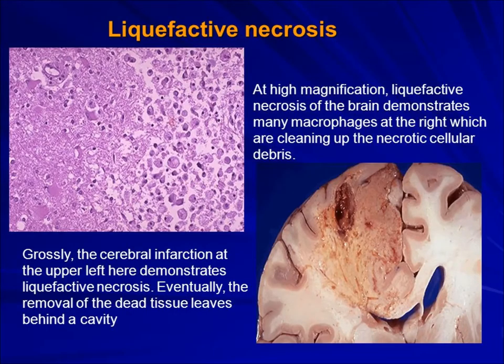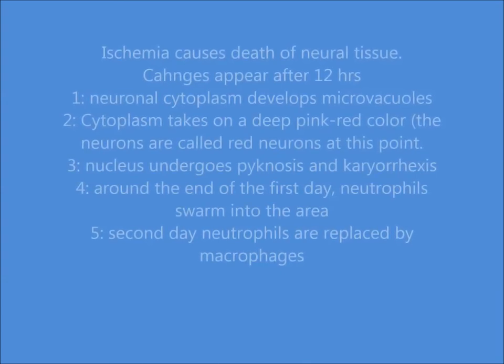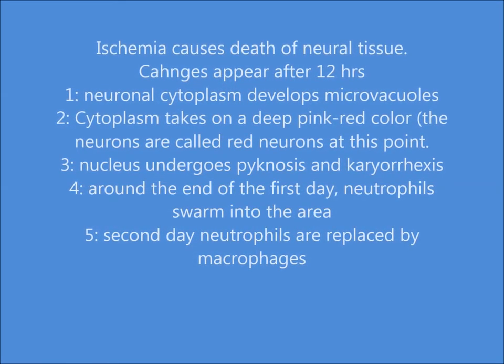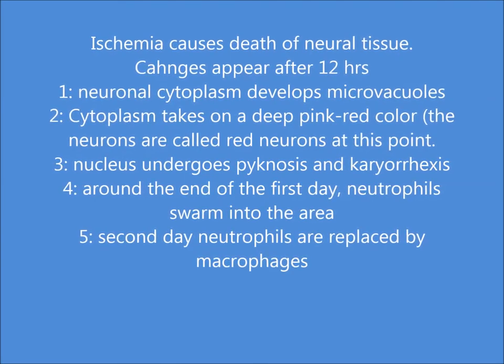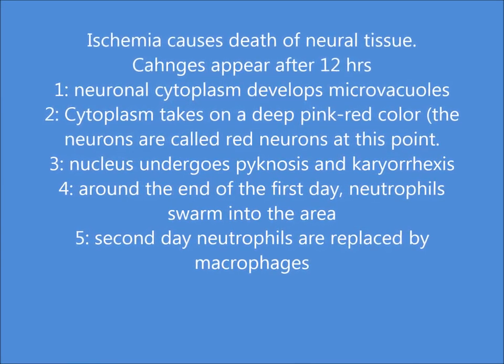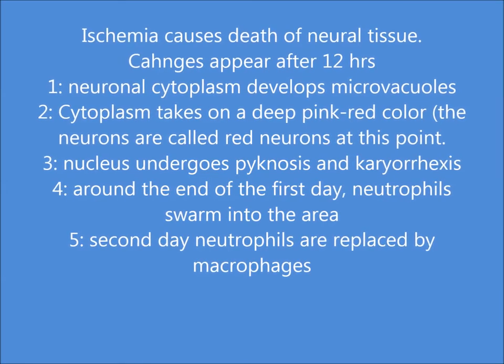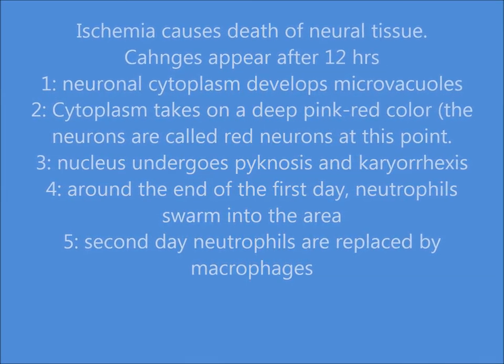Now gross and microscopic views are shown in the same picture. To summarize the findings: ischemia causes death of neuronal tissue, and changes appear after 12 hours. Neuronal cytoplasm develops micro vacuoles, there are pink-red neurons, nuclei undergo pycnosis, there are neutrophils, and then neutrophils are replaced by foamy macrophages.